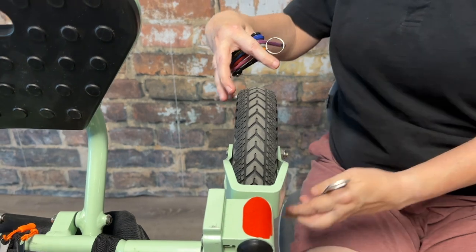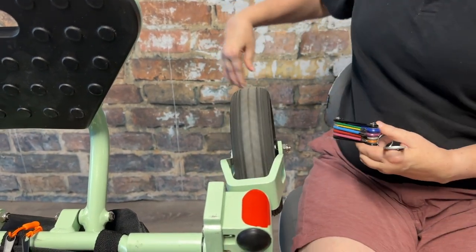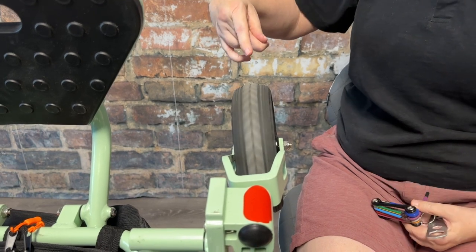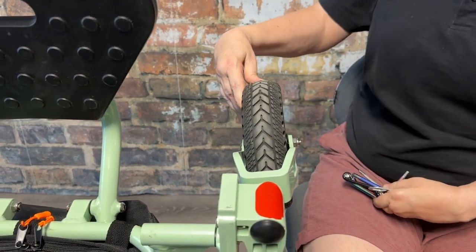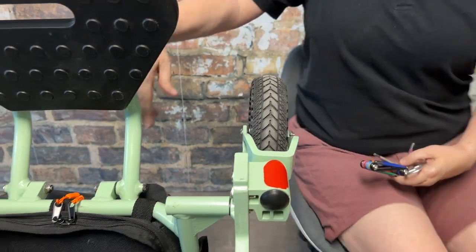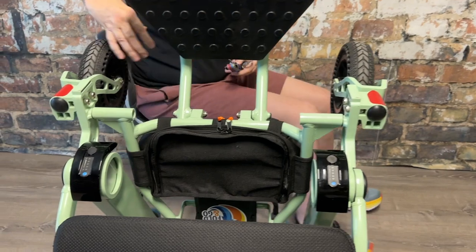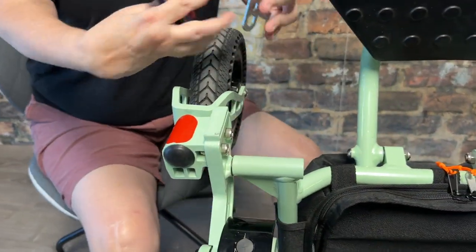While you're here, spin the tire of the caster wheel. It should free roll — that lets you know that the wheel bearings inside the tire are functioning. If it doesn't turn, you'll need to take the tire out and the wheel bearings will need to be replaced. But that is a super simple fix.